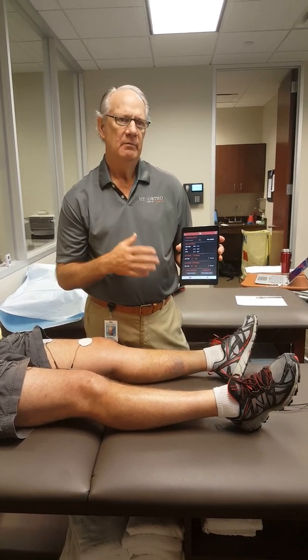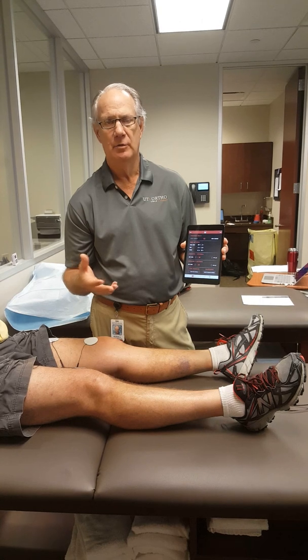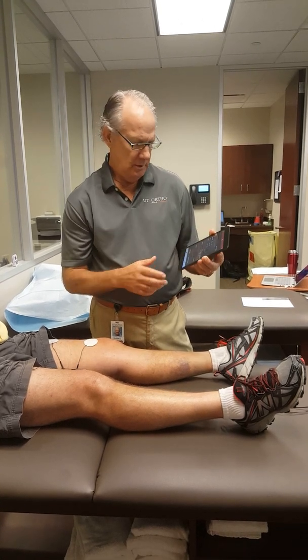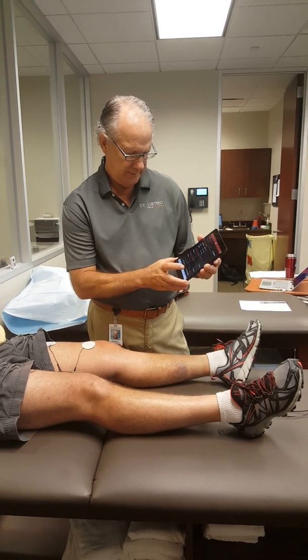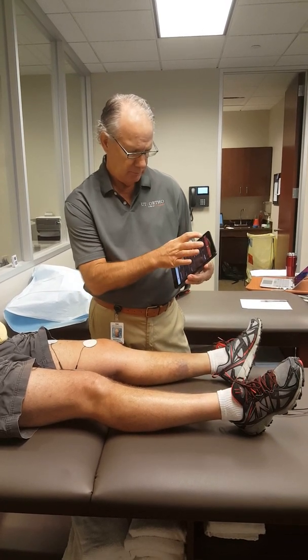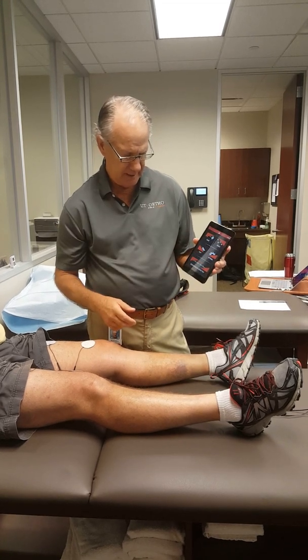I go anywhere from 1000 to 1500, and for a real healthy patient who's doing well, you might go up to 2000 on the settings. Then you just hit the save button here, and all you have to do at this point is go back and hit the neuromuscular deficit test.